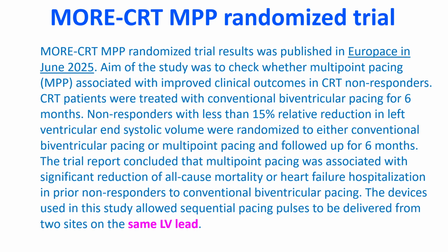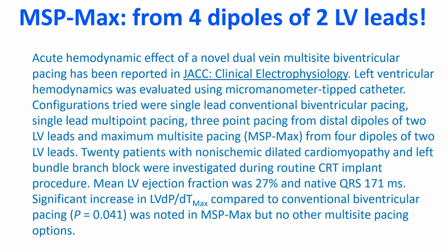The devices used in this study allowed sequential pacing pulses to be delivered from two sites on the same LV lead. MSP max from 4 dipoles of 2 LV leads. Acute hemodynamic effect of a novel dual vein multi-site biventricular pacing was reported in JACC Clinical Electrophysiology.